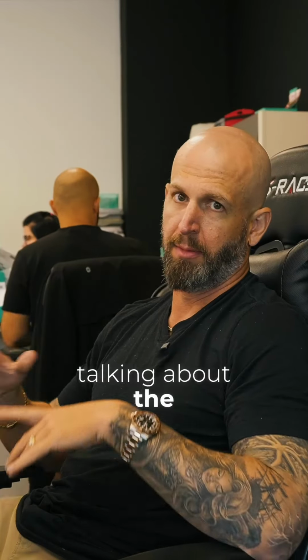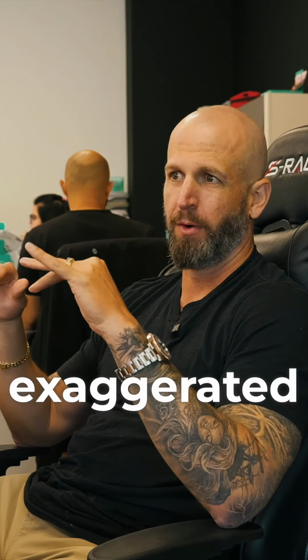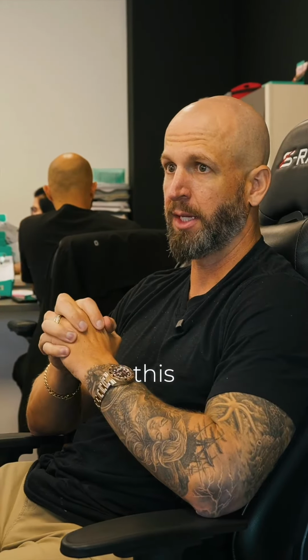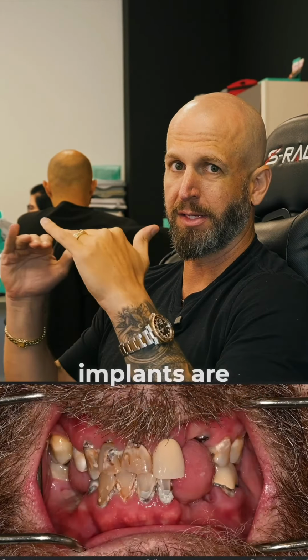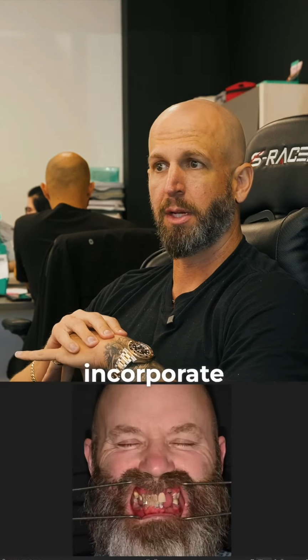So when we're talking about the digital treatment planning and the diagnostic photos, retracted photos are great. I really like to see that smile photo, a full exaggerated smile. A lot of these patients don't want to smile if they have teeth that look like this, but you can see here the vertical height of where the existing implants are. That's why we chose to use these implants and incorporate them in the hybrid.